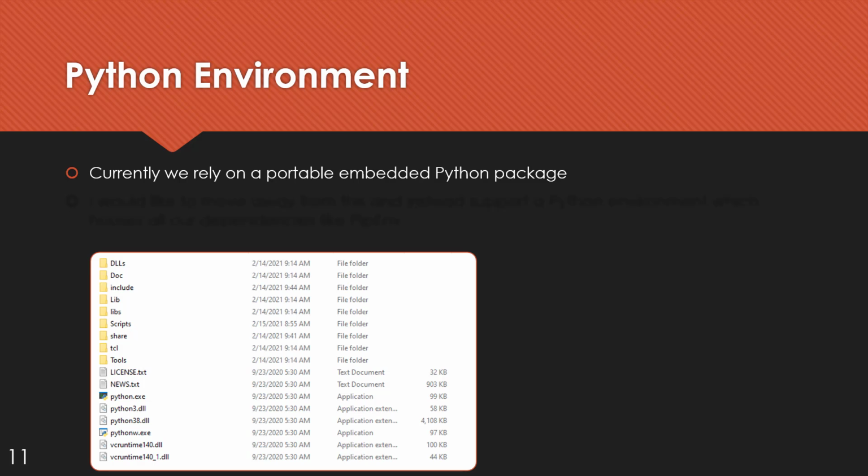Dependencies are just packages of software that our software is dependent on in order to function. They're what enables programmers to build off the backs of previous programmers and not have to worry about reinventing the wheel. Right now, for simple use of BCPy2000, we offer a portable package that almost anybody can download on the wiki and have it work out of the box.